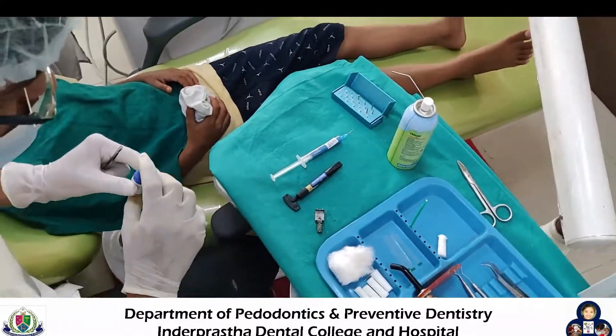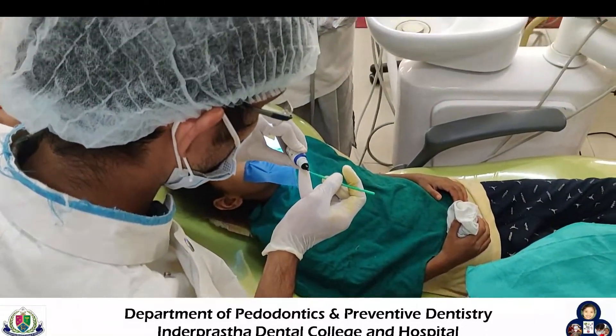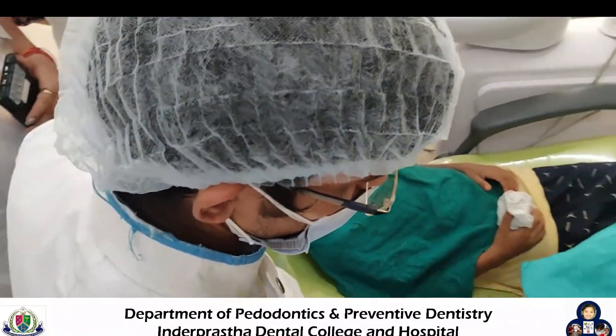After this step, bonding agent is applied over the tooth surface for 15 to 20 seconds. After 15 to 20 seconds, the bonding agent is cured for 30 seconds.